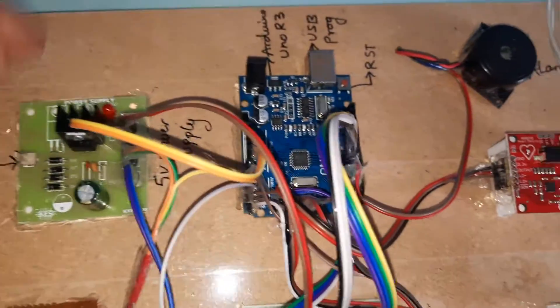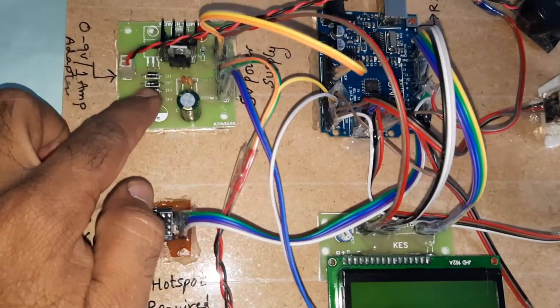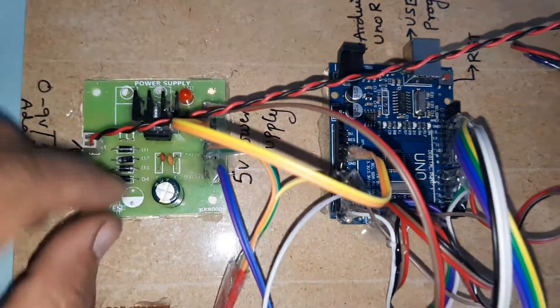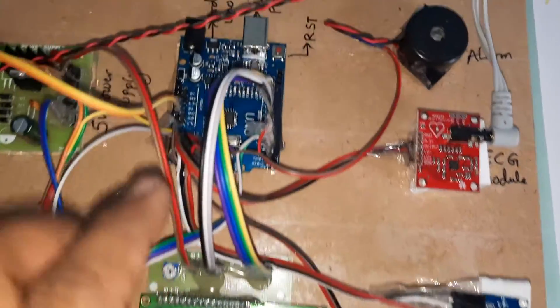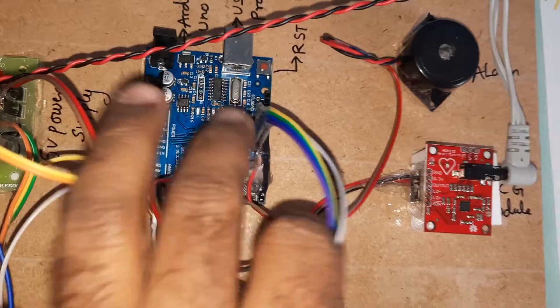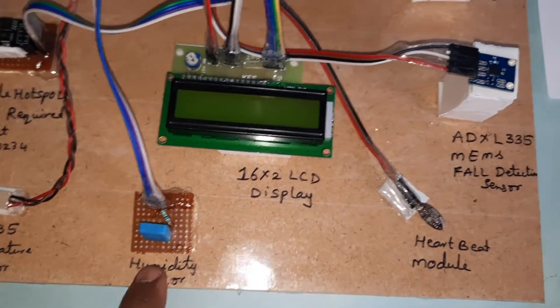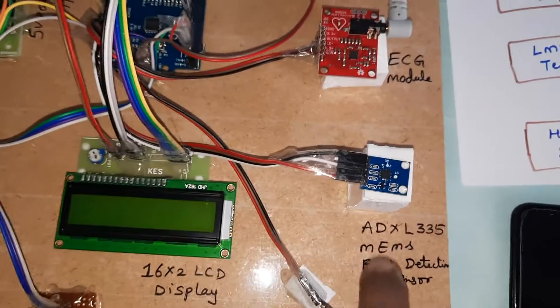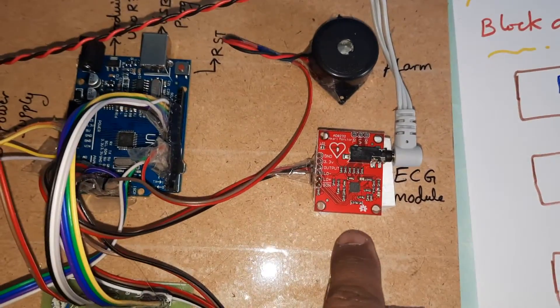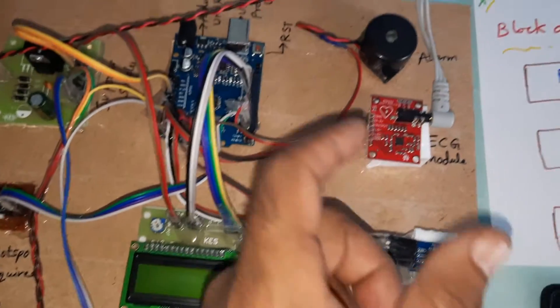Now for the hardware part: we are using an input power source with a bridge rectifier, filter capacitor, 7805 voltage regulator, and one LED. We use an adapter power source, Arduino Uno R3 board, and a 16x2 LCD display connected to pins 8 through 13. LM35 temperature sensor on A1, humidity sensor on A2, heartbeat sensor on A0, fault detection on A4 and A5, ECG on A3.